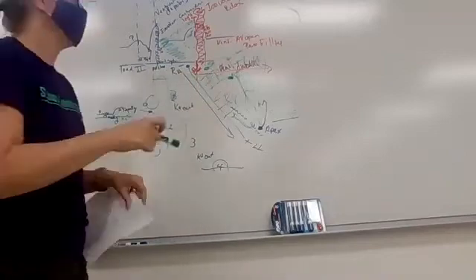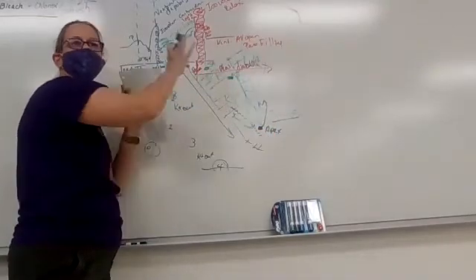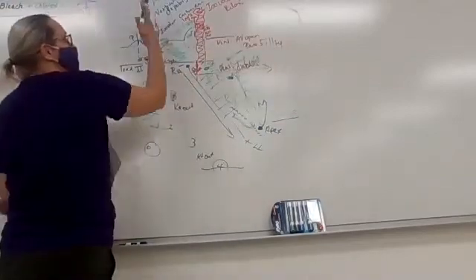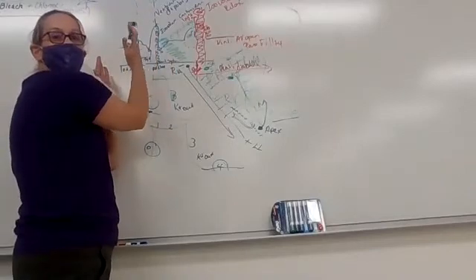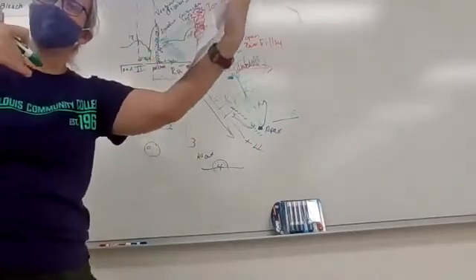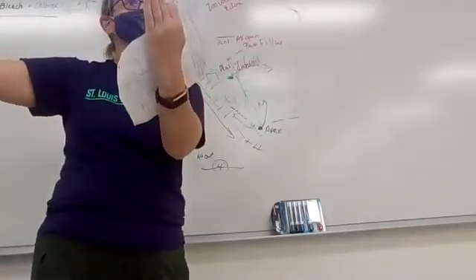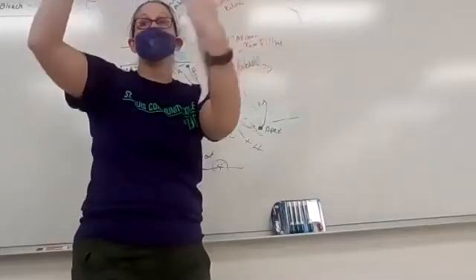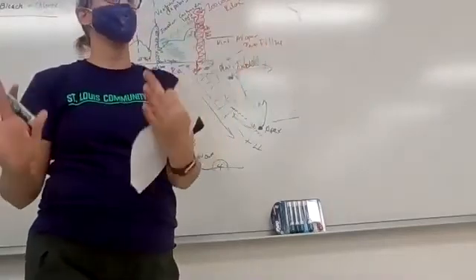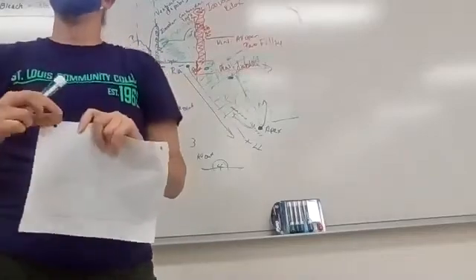And that's usually where we know the conduction system is working from the AV node to the apex, the ventricles are depolarizing, the ventricles are repolarizing. And so the front half of the EKG, the P wave to the QRS, that's related to what's happening between the SA node and the AV node, what's happening with the atrial cells. The QRS complex to the end of the T wave, that's what's happening between the AV node, the bundle branches, the Purkinje fibers, and the ventricle depolarizing and repolarizing. Okay? General rule of thumb.